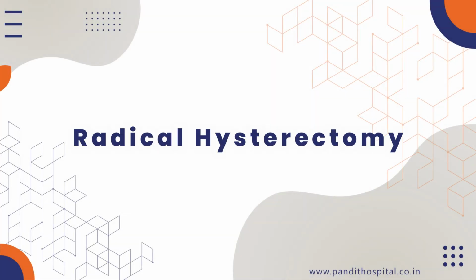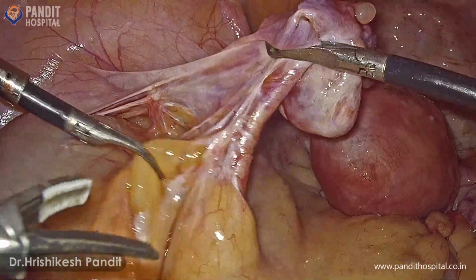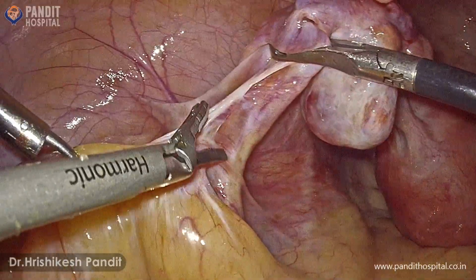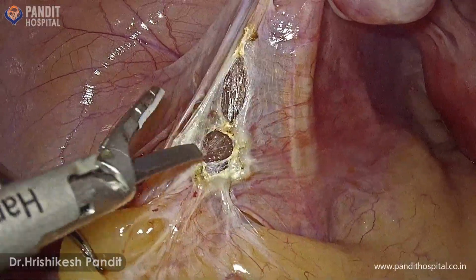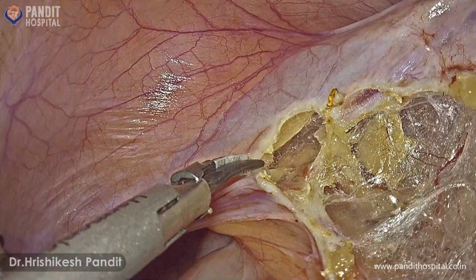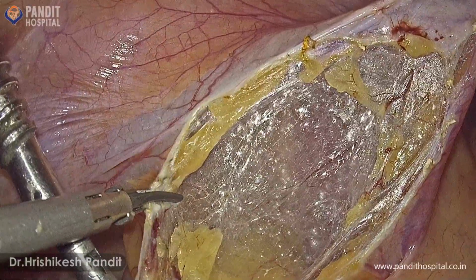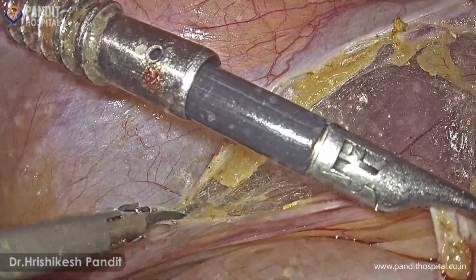Dr. Hrishikesh Pandit. Today we are going to demonstrate to you a step-by-step procedure of laparoscopic radical hysterectomy type C1, that is nerve sparing type of radical hysterectomy in a case of stage 1B2 cancer cervix where cervical growth is of 2.8 cm size.